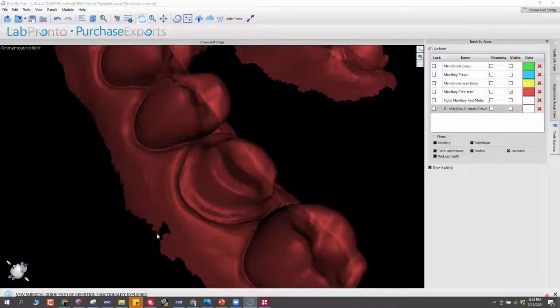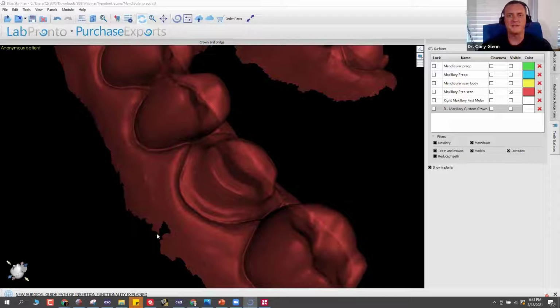Okay. I see here, what is a good printer to buy that balances the cost and features? There's so many good ones now. The SprintRay Pro, I think, is the fastest right now that I'm aware of. And it's got a huge build plate, so that's a big plus. Again, I've also got this Form 3B printer. It does an excellent job. It's really clean prints. It's somewhat of a closed system because you can only print their materials, but they actually have this permanent crown and bridge material.